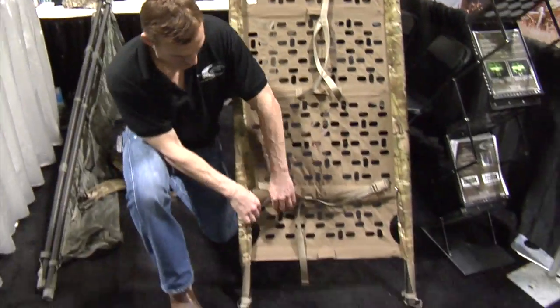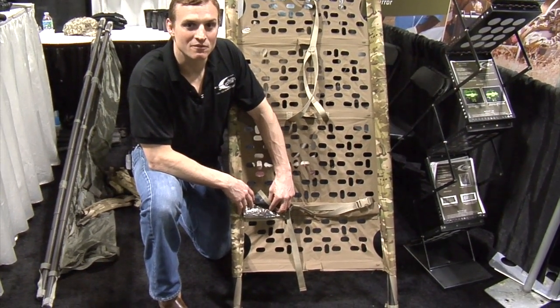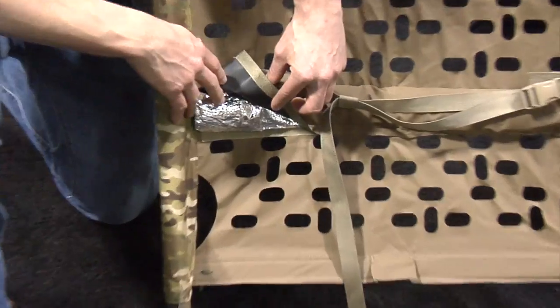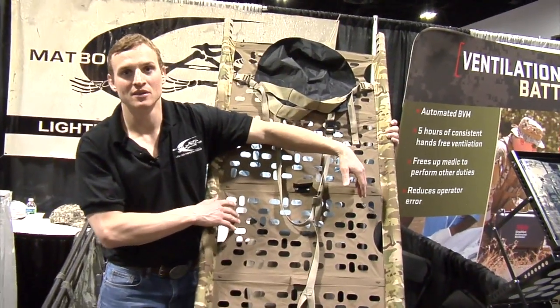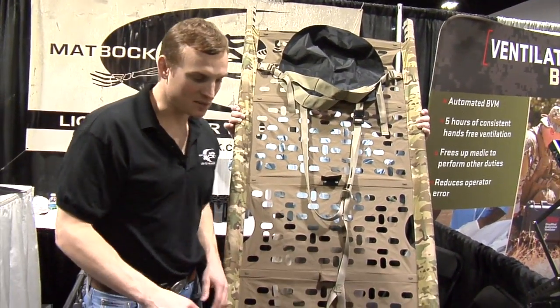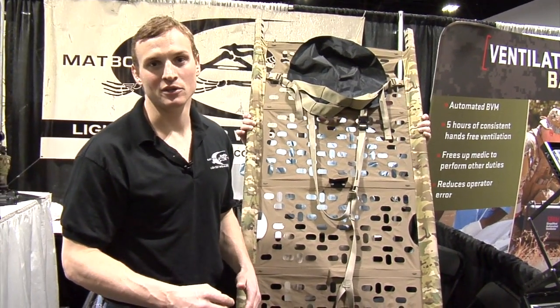Down here at the bottom, we have an integrated Mylar emergency blanket for heat control for the patient. Shiny on one side, black on the other. Simply pull the blanket out, up and over the patient, and tuck in on the sides. The Mylar blanket itself is completely removable and replaceable in the event of any bodily fluids or tears.